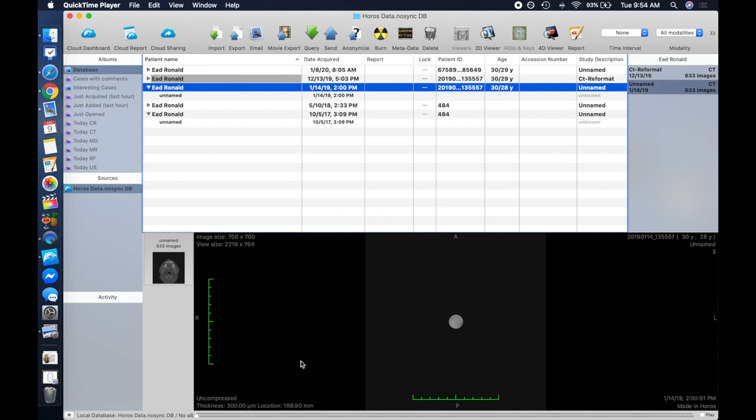And then in January 2019, as you're about to see, a CBCT revealed that the bone from around my front teeth was pretty much gone while I was still in controlled arch braces. So what this video is, is two time points being compared.